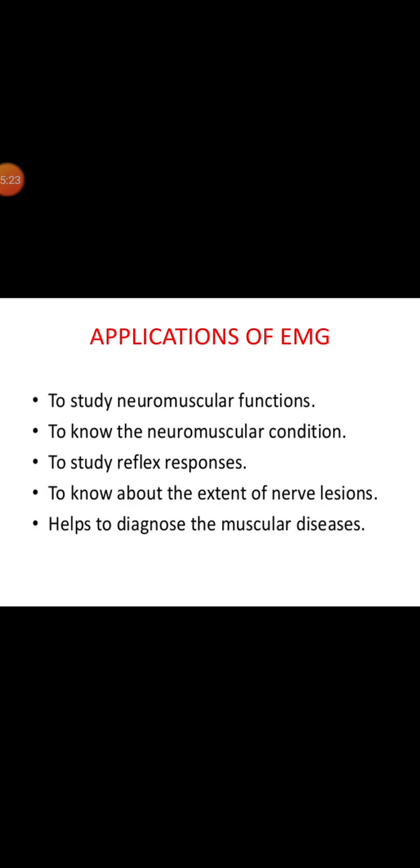So, the main applications of EMG are: it is used to study the neuromuscular functions and to know the neuromuscular condition, to study reflex responses, to know about the extent of nerve lesions, and it helps to diagnose the muscular diseases.